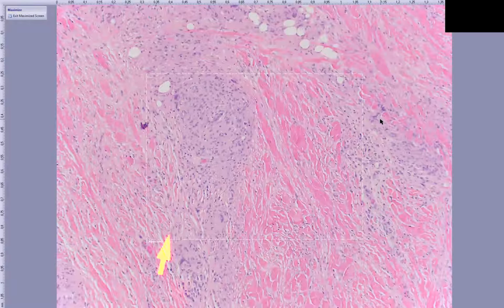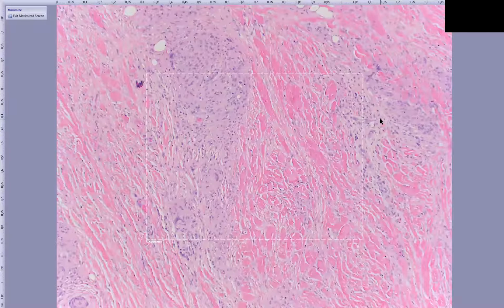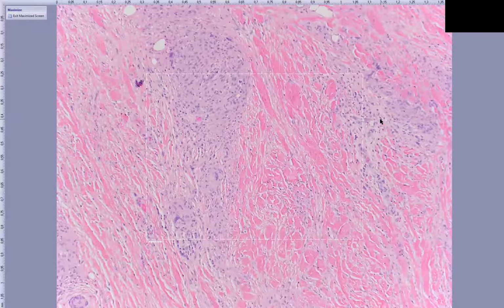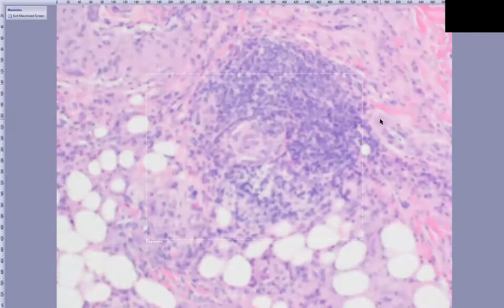So tiering of collagen necrobiosis alternating with zones of epithelioid histiocytes. And so instead of having smooth diffuse sheets of histiocytes, you're really having these horizontal arrays. The lymphoplasmacytic infiltrate in necrobiosis lipoidica is denser than what you see in NXG. So here we are.